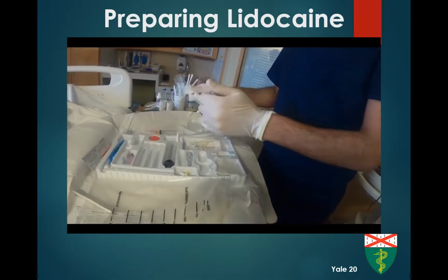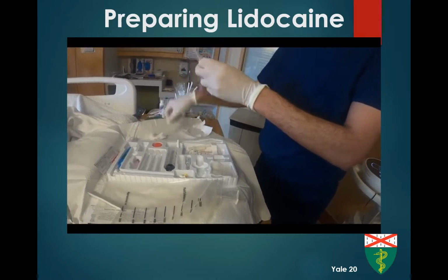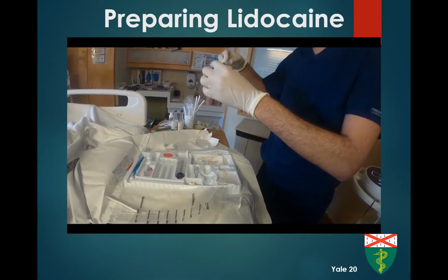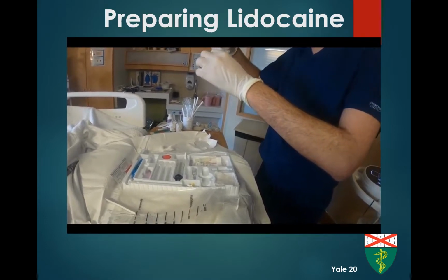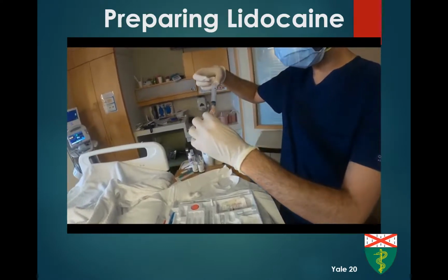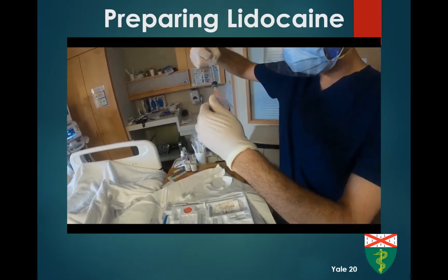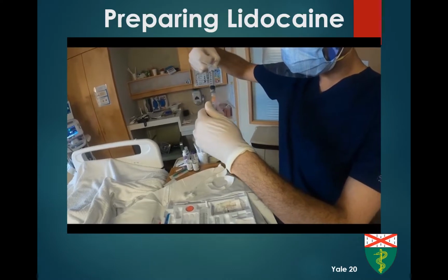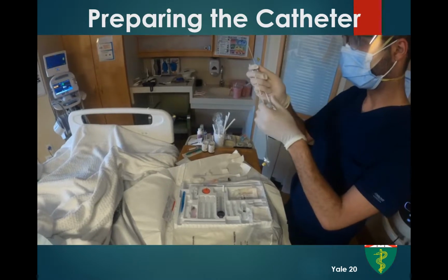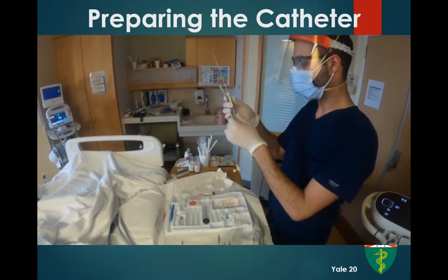Once the sterile field has been created, it is important to prepare the rest of the supplies. The lidocaine container should be carefully opened and then the lidocaine drawn into the syringe. It is also helpful to place gauze on the sterile field for easier access during the procedure. Here, the catheter is prepared by placing the needle within the catheter sheath.